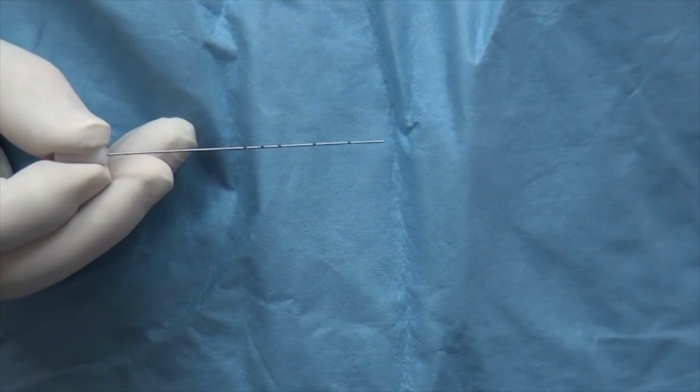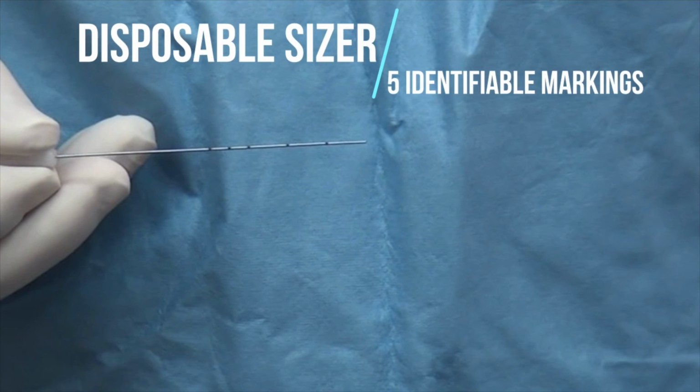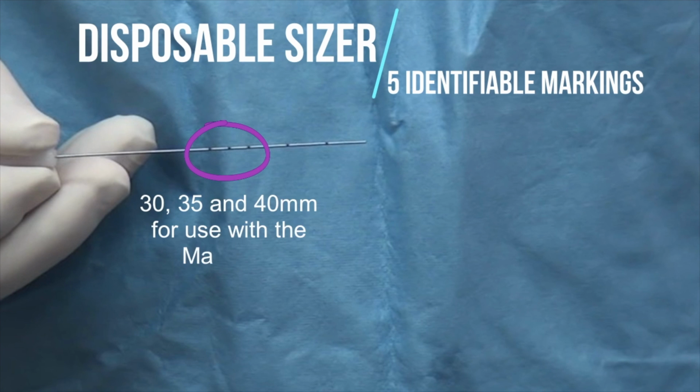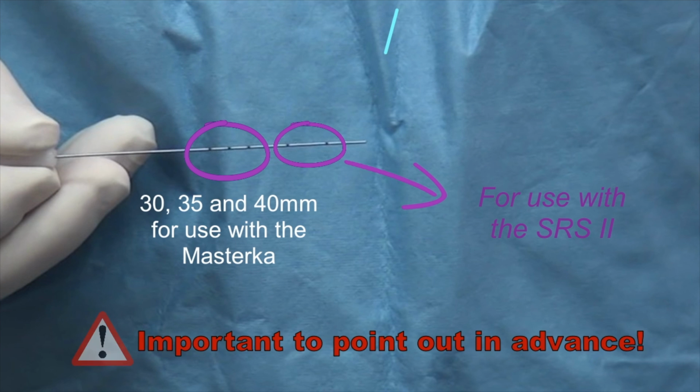There are 5 identifiable markings on the disposable sizer. The 3 marks nearest the white end cap of the sizer are at 30, 35, and 40 millimeters for use with the Masterka. The 2 markings closest to the distal tip of the sizer are for use with the SRS-2 and will not be used with the Masterka. It's important to point this out in advance so that there is no confusion.